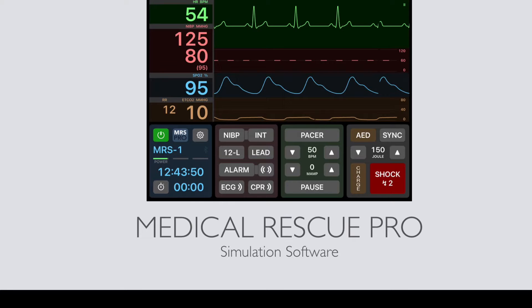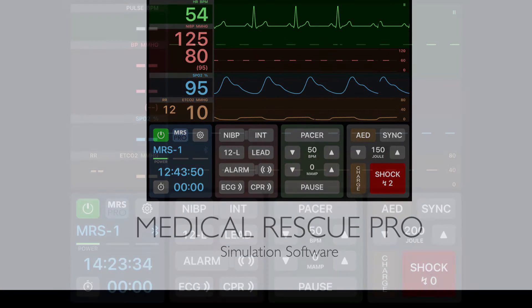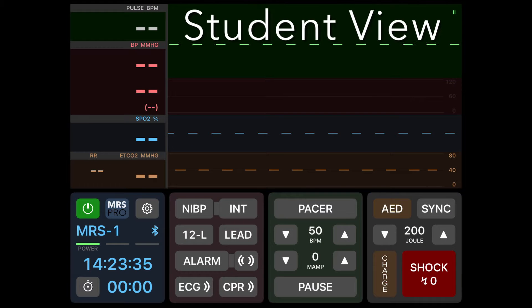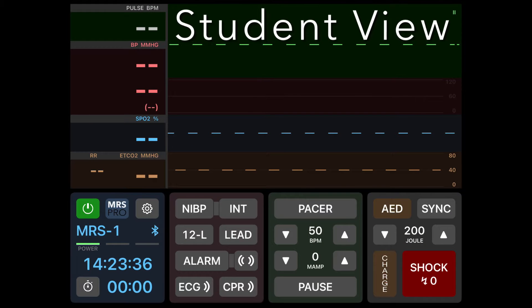Part of running an effective megacode scenario is the effective use of simulation software. This video will review the Medical Rescue Pro simulation software. Let's start by looking at the simulation view that the student will be seeing.